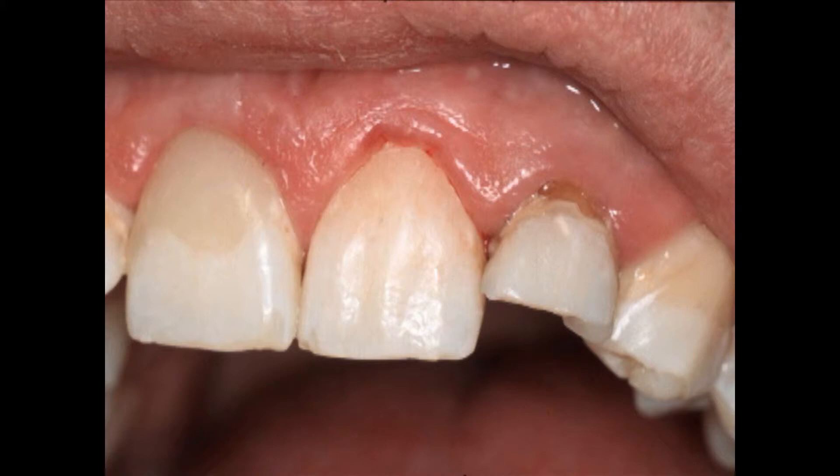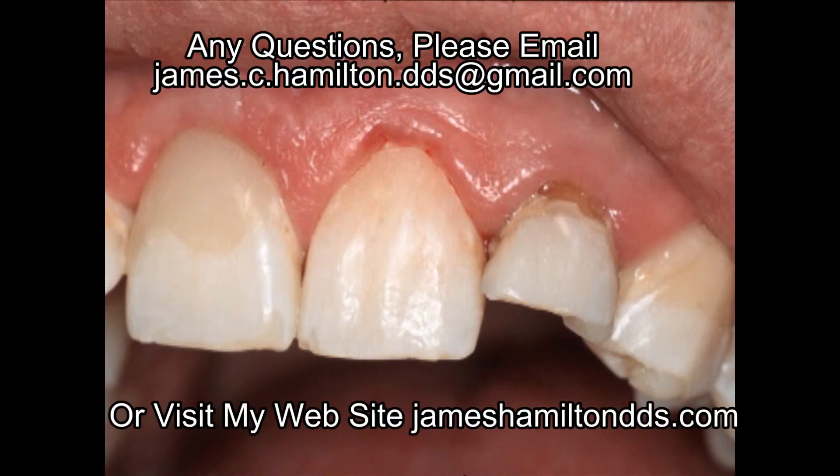Five to ten minutes of chair time has been saved because we used a clear custom matrix that reforms the unset composite and leaves a surface that is not air inhibited and needs minimal, if any, finishing or polishing. This saves the dentist and patient five to ten minutes of chair time.